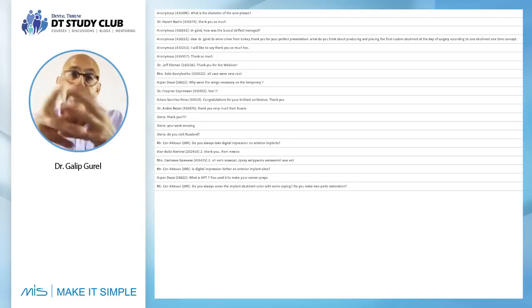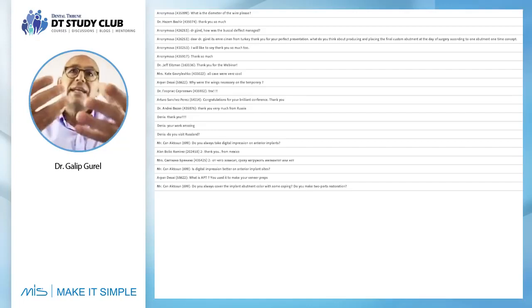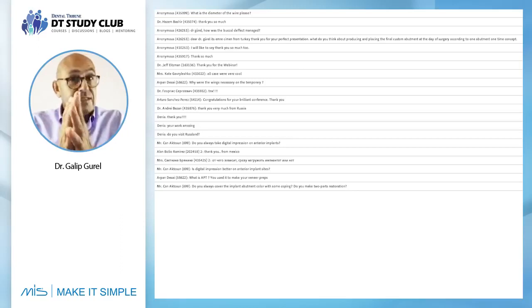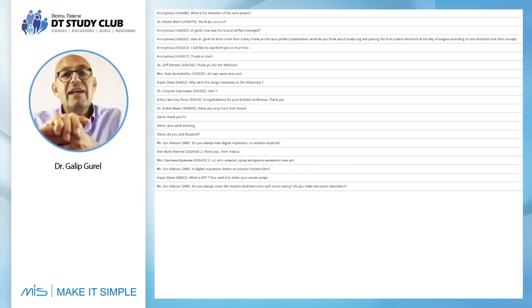Second issue, as far as I understand from here, is that you are asking about going in and out of the socket. This is absolutely correct. This is why abutments like Connect or multi-unit are extremely useful here, because once you tighten it up, you don't need to take it out. You carry everything to the soft tissue level, and all you need to do is play with the 1 millimeter, which will be in very, very safe limits.